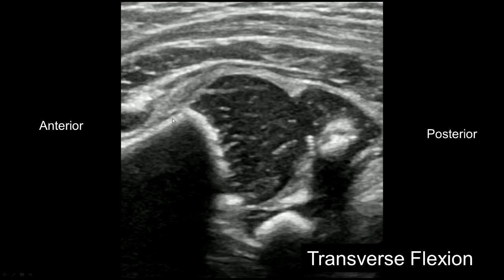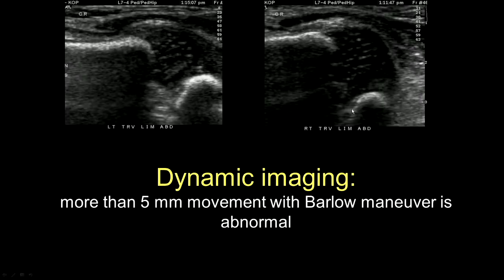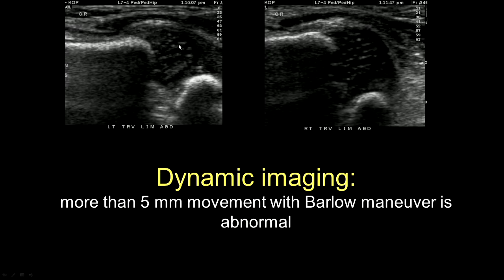This is the transverse in flexion, where you have the femoral shaft, the femoral head, and the cartilaginous posterior acetabulum — it should be nicely seated. Here are two images from a dynamic study where we're doing a Barlow maneuver, doing adduction, and pushing back. More than five millimeters of movement posteriorly is considered abnormal.